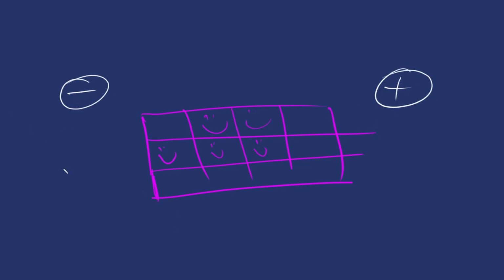So if our first guy, let's say this guy here, he decides he wants to go off, he's going to send the signal in all directions, right? But let's say it's going this way. If it's going that way, because this is a straight line, we're going A to B to C, right, along this line. So from the negative to the positive, since it's going towards the positive, it's going to see a positive deflection.